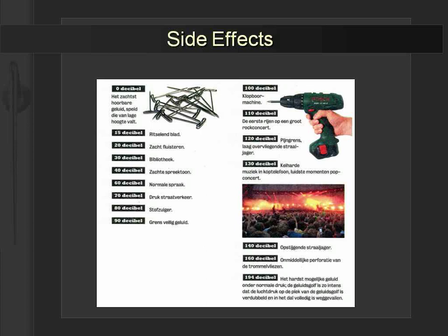This came with New Year's Eve, so we have a lot of fireworks, and you in Sydney as well. What it tells you is the amount of sound that you get from an ultrasonic tip. It's approximately 80 decibels. This is the Dutch word for vacuum cleaner, so it's approximately the amount that you get with a vacuum cleaner. So there's no danger with respect to impairing your hearing when you use an ultrasonic unit.